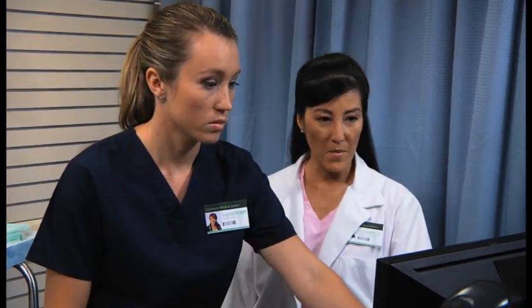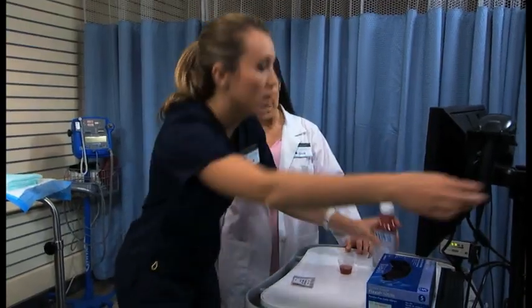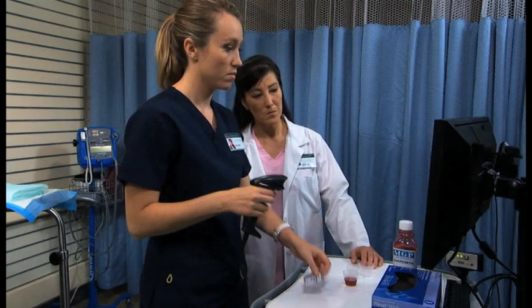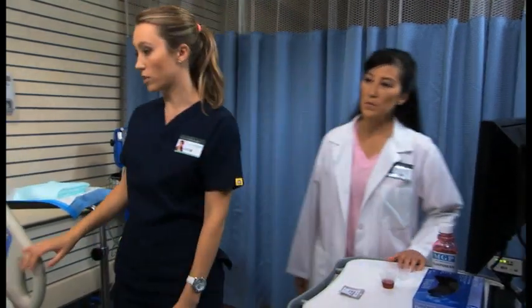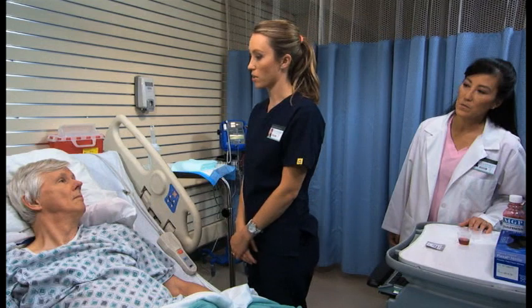And you'll want to remember to check the medication labels for the third time with the medication administration record. Okay, guaifenesin, 400 milligrams, 10 ml, and furosemide, 20 milligrams. Okay, they both match. So we're good to go, Mr. Lumet. Just 2 for now. I have your guaifenesin to decrease your cough and your furosemide for your blood pressure.